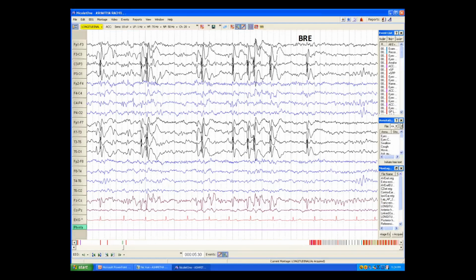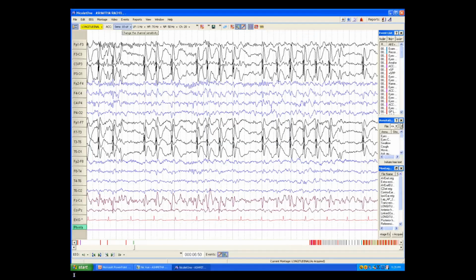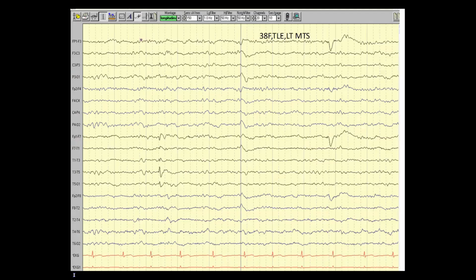In benign Rolandic epilepsy, you can see the left centroparietal or centrotemporal spikes, very frequent in sleep. So this is one situation where, as the sleep produces plenty of spikes, the condition becomes more and more benign. That is, you see a lot of spikes in the EEG, but we can counsel the parents that it's going to be a benign scenario. So this is benign Rolandic epilepsy.